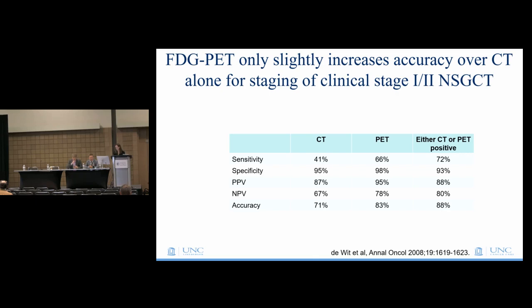I will say, in light of the fact that my institution doesn't have very much IV contrast right now, if you're staging new testis cancer patients and you don't have IV contrast, it would not be unreasonable to get a PET-CT to help stage, although it's clearly not standard of care, and I don't know about insurance reimbursement.